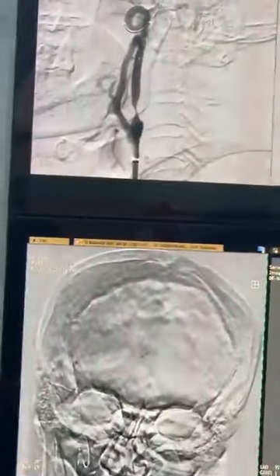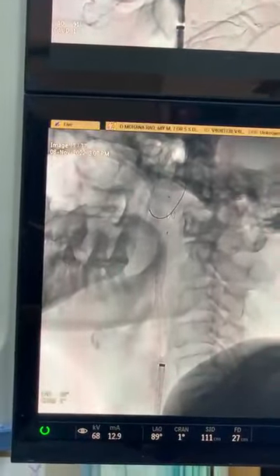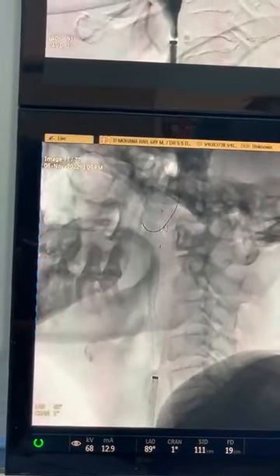That's a good cerebral circulation. We will take a better picture if the patient cooperates at the end of it, after removal. That's also important. Can I have the retriever?